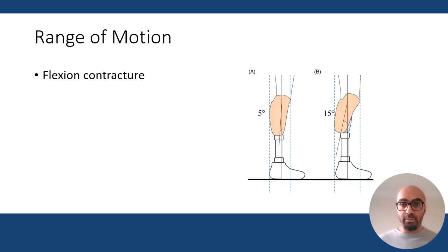One of the crucial ones is having a proper knee range of motion. It's really important to make sure that we don't have contractures, and the physiotherapist will jump in on that one and make sure we don't have that much. So assessing the joint range of motion is crucial, and the presence of a knee or hip flexion contracture can have a large impact on the position of the prosthetic socket and can prevent them from wearing it. This can compromise the knee flexion in setting, the aesthetic appearance of the prosthesis, the weight of the prosthesis, and the component selection, as well as making manufacturing challenging. And you can see the example on the picture.